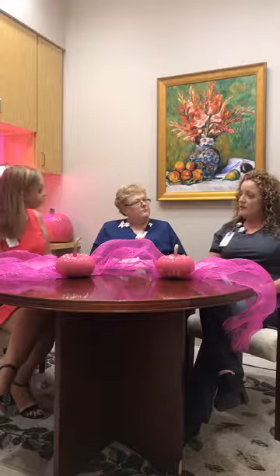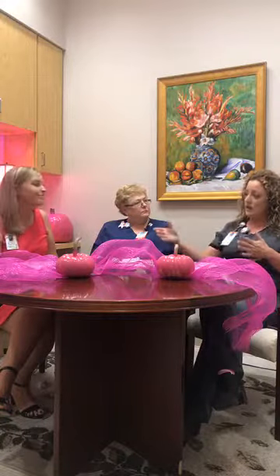Now you mentioned it's just going to be roughly 2 images of each breast. How long does a normal mammogram take? Just how long should they expect? Sometimes people dread going to a doctor's appointment because it takes a long time. How long, kind of door to door, in and out, with paperwork and everything? Sure. Probably 30 to 45 minutes. Because you're going to be in the room with the tech for 10 to 15. The actual mammo itself is going to be about 10 to 15. But with your paperwork and changing clothes, give it a good 30 to 45 minutes. Not bad. Not bad at all.